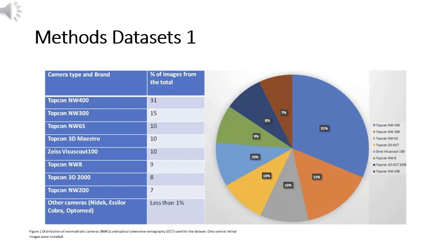The dataset includes color fundus photography, CFP, macular OCT, retinal nerve fiber layer OCT, RNFL, and other added non-medical images trying to fool the AI, such as round objects like pizzas or photos of the full moon. Of the 306,302 images, over 250,000 correspond to CFP. In 2017, Optretina published the results of 3 years of screening, detailing the percentages of diseases found.